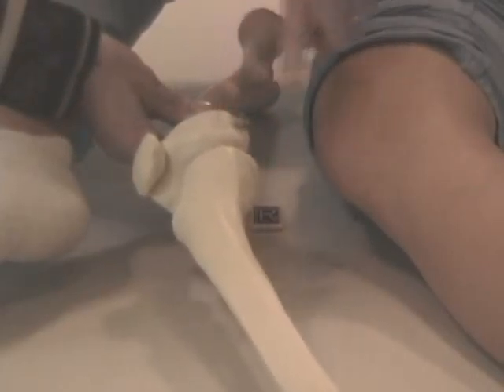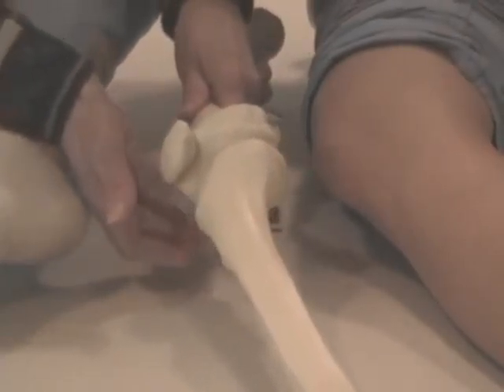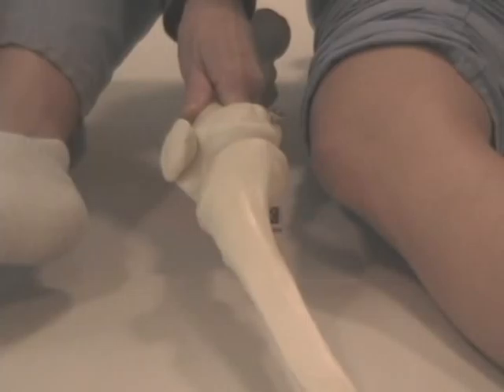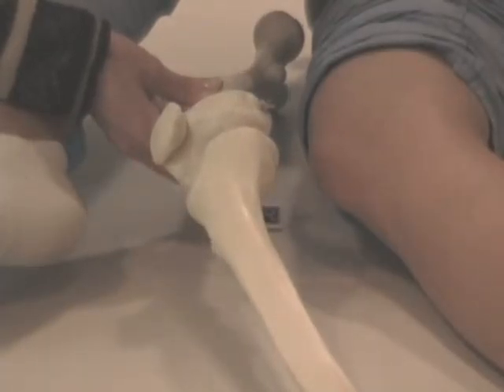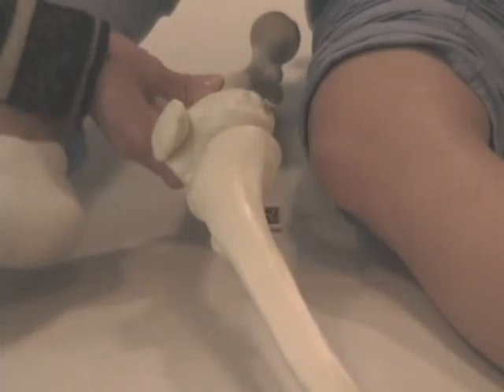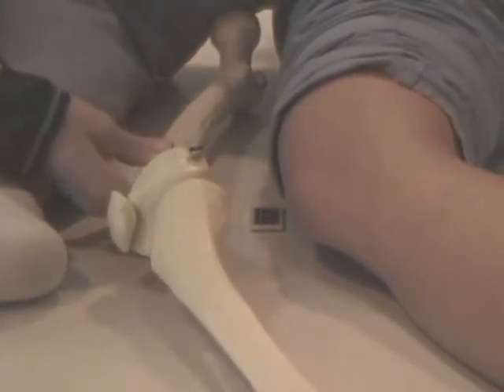It will be in a posterior relationship on the leg, because the lateral condyle is going to be anterior, and this adductor tubercle will let you know the medial condyle is too posterior. You shot that image with the knee too far away from the table, and to fix the scenario, you need to bring the patient closer to the table.